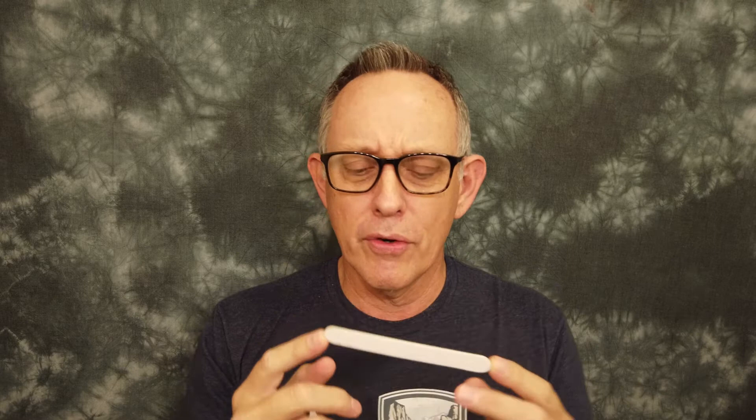Every aligner company sends you one of these and they say it's for making any adjustments, knocking off high spots or trouble spots, and you use it to sand off any imperfections in your aligners. Well, what this is is a nail file. If you use this on some of the other aligners you may not be able to tell that you've done any work on them.